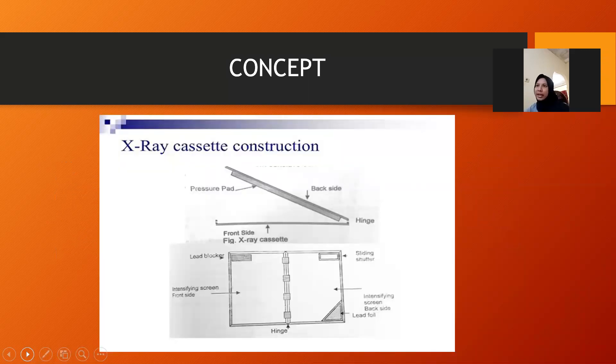As you can see on the image, this is a picture of the cassette and its parts.